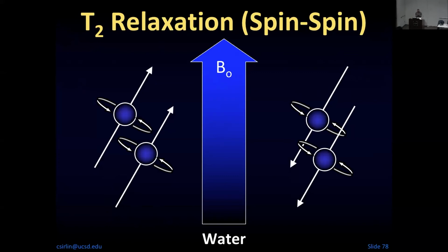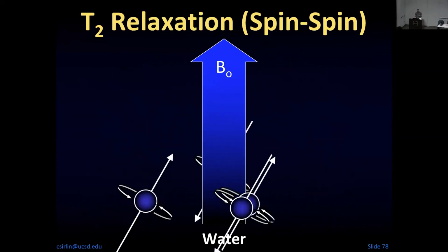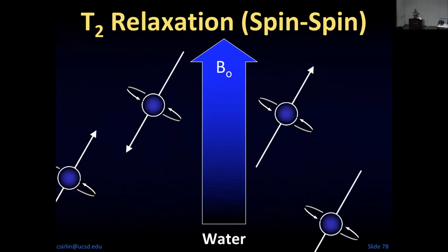But now let's ask ourselves a question. This effect of the protons on the external magnetic field, what does it actually look like? Well, let's take water protons. These water protons are pointing up, and these water protons are pointing down. But do the water protons just sit there? No, the water protons are going to be moving, and they're going to be moving very, very fast. Just like a swarm of bees, they're going to create this uniform buzz that's going to be adding and subtracting to it.